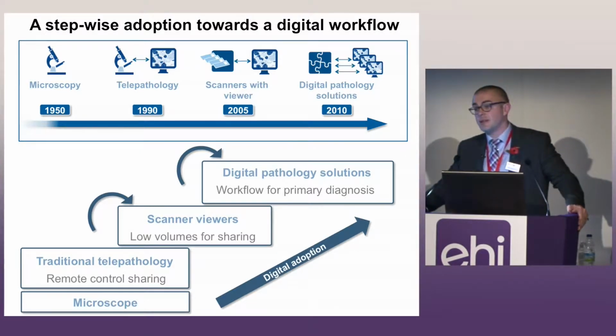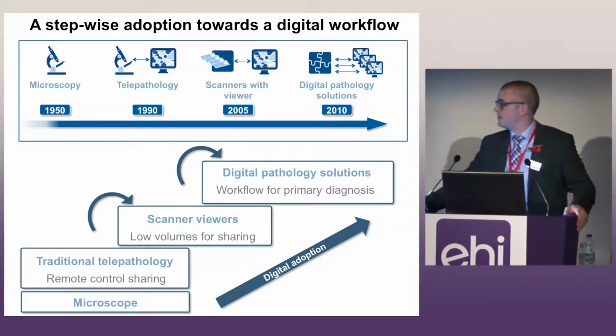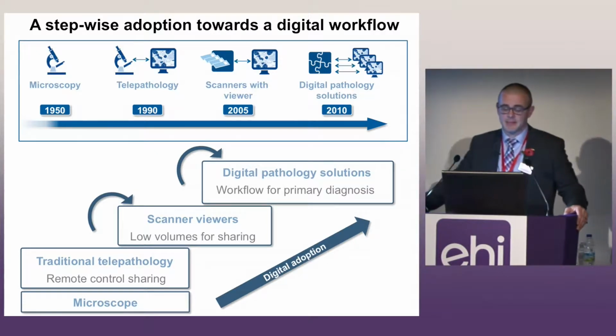It wasn't until the 90s that compression algorithms and wide area networks and video formats had developed to such an extent that they could be coupled with the microscope for wider area reading of pathology slides. Fast forward 15 years or so, and scanner manufacturers had developed their products to such an extent that they could get the level of resolution required to provide that level of detail.